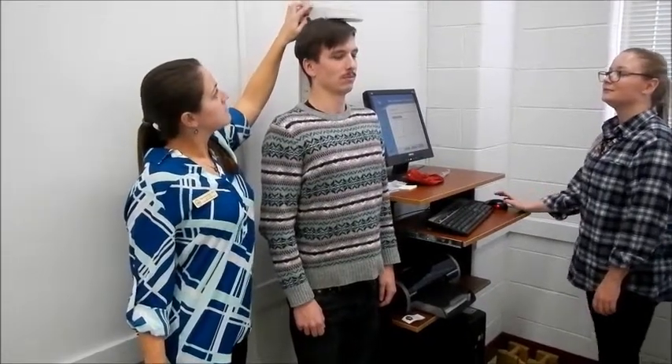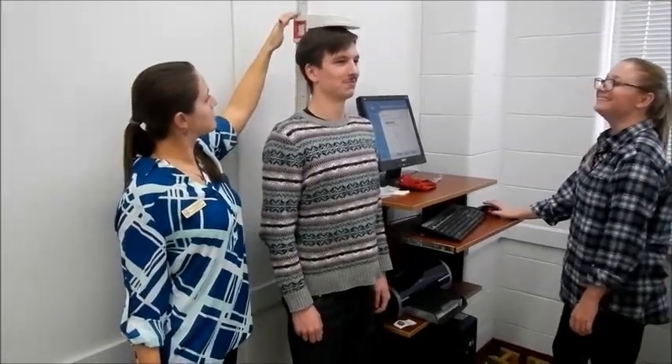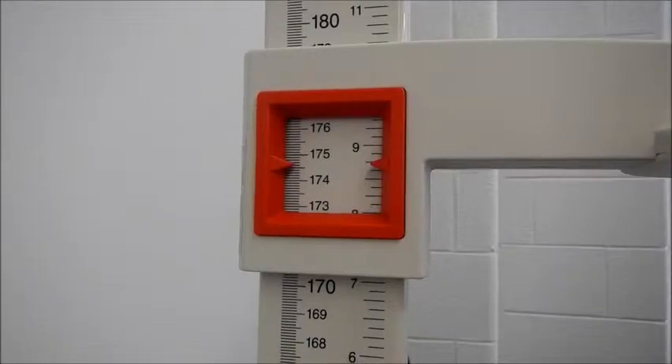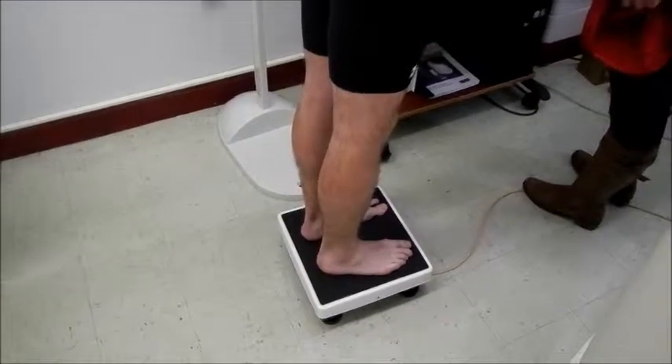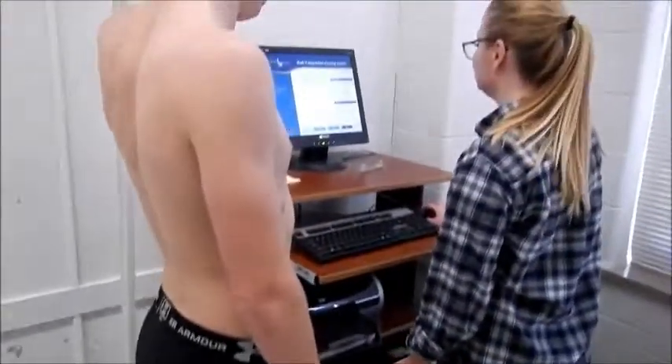Begin with taking height and weight measurements of the patient. When weighing the patient and before placing them in the bod pod, it is important that they're wearing only approved clothing. Approved clothing can be spandex tights or any clothing that would minimize air displacement in the bod pod.